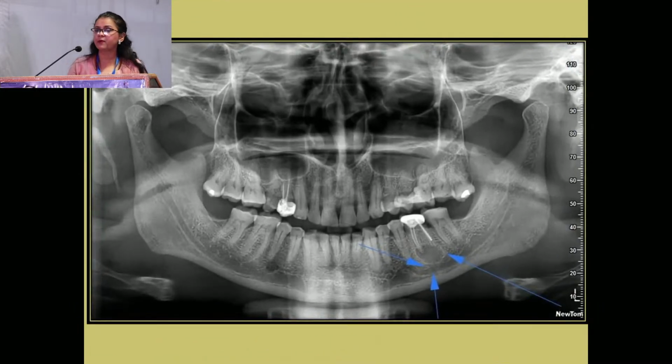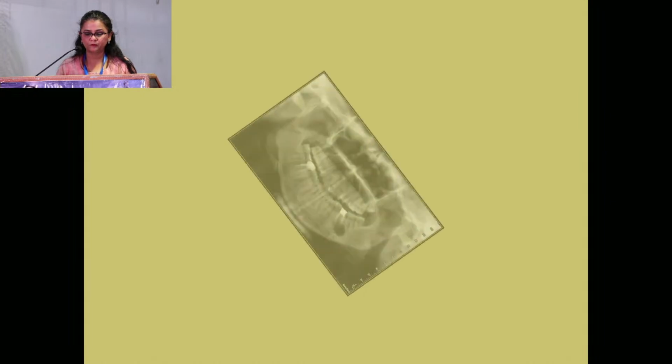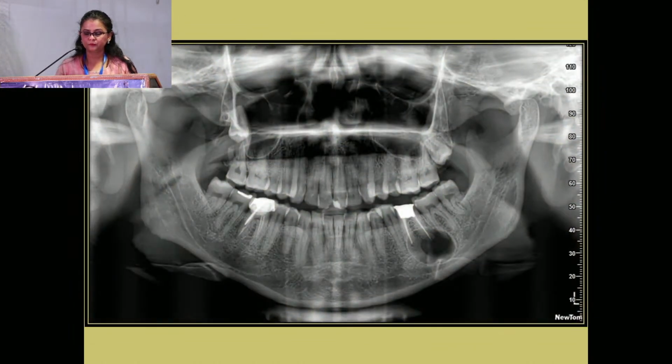Now this is a periapical radicular cyst encroaching on the inferior alveolar canal, causing bending of the canal. So this type of measurement can be done on the OPG, but it's not a reliable measurement. It's just a two-dimensional measurement. You can't give the measurement in all three dimensions. See the difference? You have a radiolucency within the radiolucency.